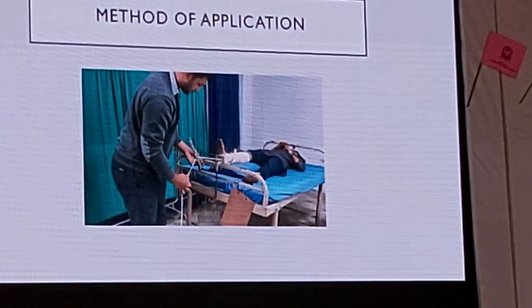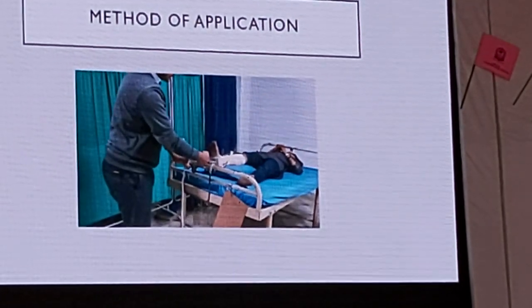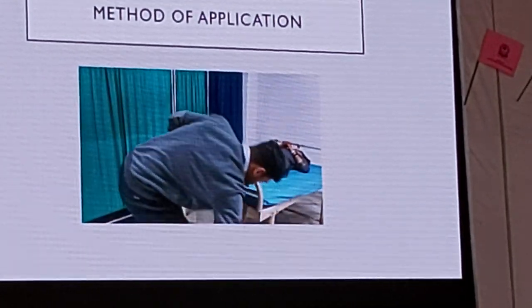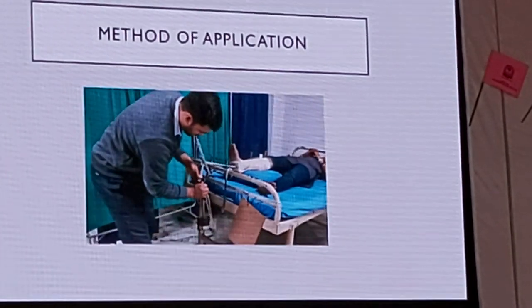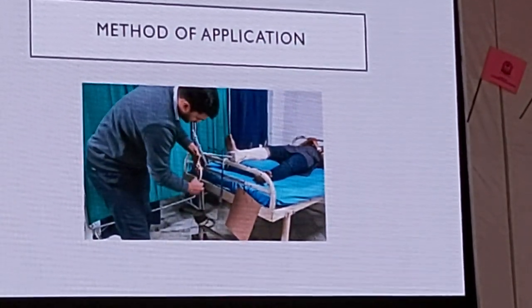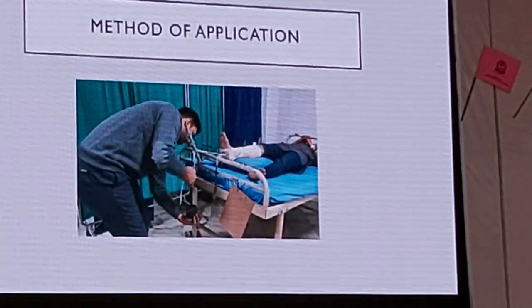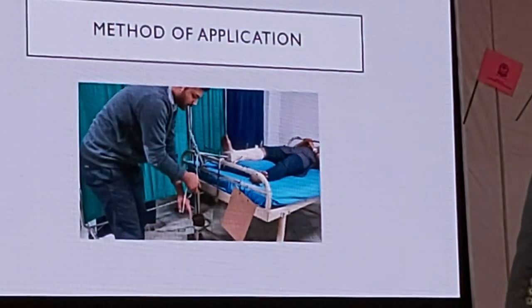Once you have adjusted the angle as per your requirement, you will take the rope at the foot end and tie it with the calculated weight. It should be ensured that the suspended weights are at the midpoint between the bed and the floor for proper traction.